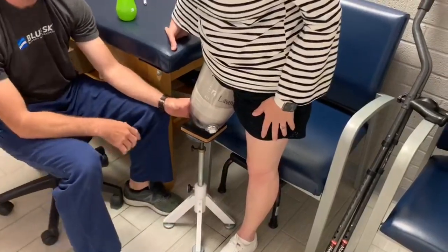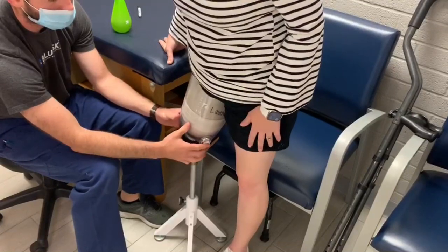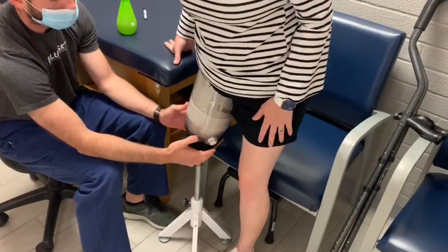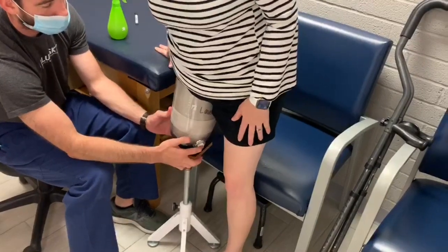So now go ahead and push into it a little bit. Oh, wow. Now back up, back down, back up, back down. Do it a couple more times.